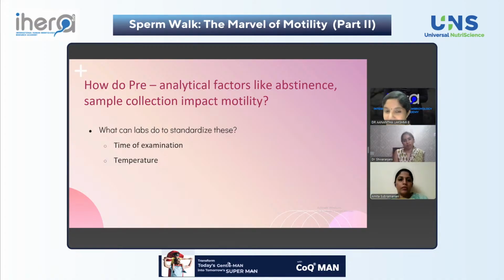Yeah, it is fine, but it's better to have one small incubator, because first of all, the room temperature keeps getting varied. So you don't know when you see the lesser motility. Since we are doing motility in the newer parameters, like when you are counting rapid progressive, then progressive, then non-progressive, in this kind of motility check, the temperature plays an important role. Otherwise, the other forms of motility will go down, and you will have an incorrect report. So I think temperature should be uniform all across.